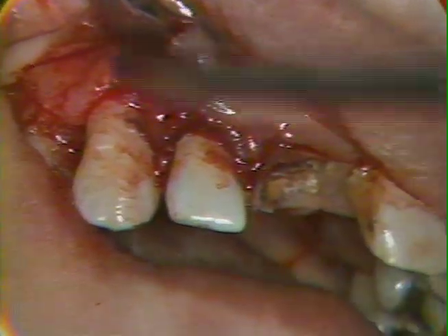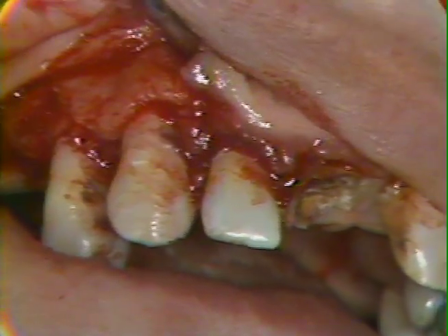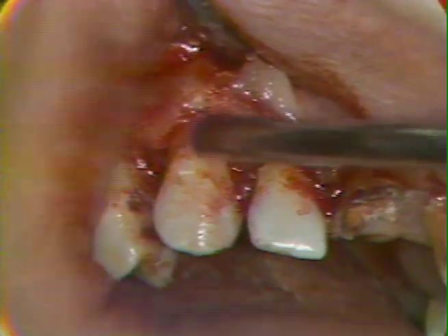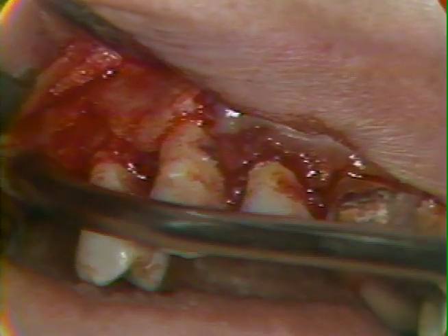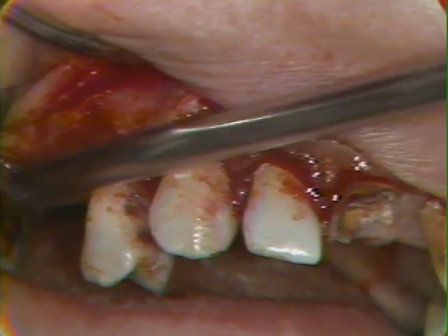some undercut here, and I'll take those rongeurs once more, and we'll try to just trim some of the collar of prominent bone around the cuspid itself. What we'd like to do is remove these two teeth without fracturing the alveolar process. So we'll take the number 150 instrument now. I have direct vision, and I'm carefully, just open widely now, applying the beaks of the forceps one beak at a time.